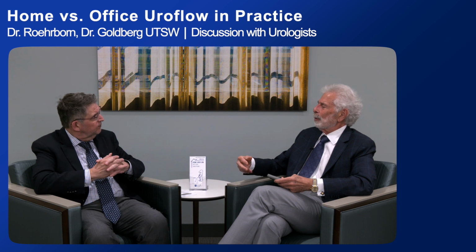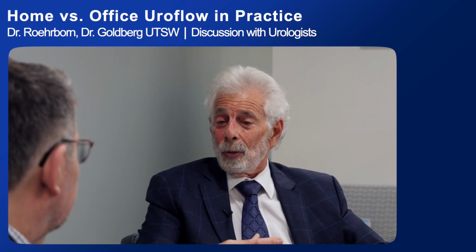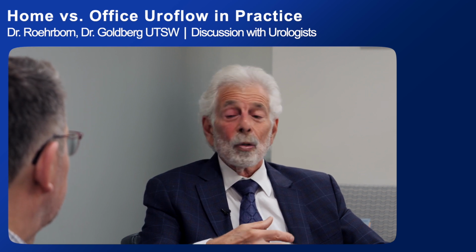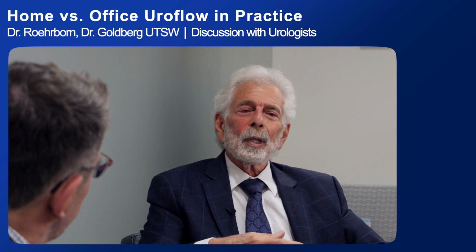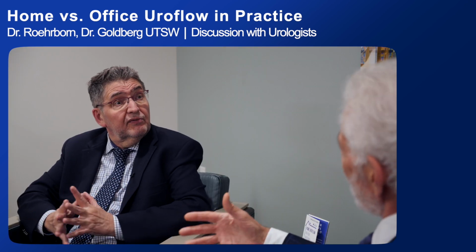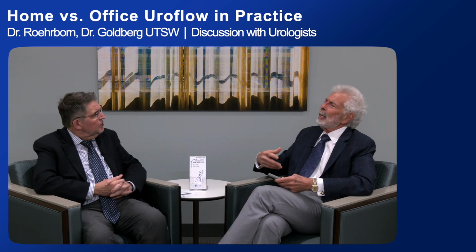I'm sure you could probably do one for a clinic, but each urologist can get his own code. Right. So that's unique. The patient just puts his name and birth date in, no other demographics. They are working on more symptom scores and medications and surgery. Sure, but right now it's the flow rate. It's the flow rate and the volume. So walk me through it.